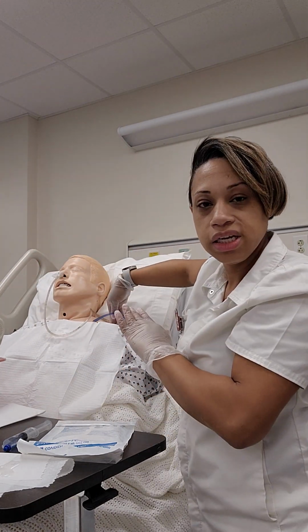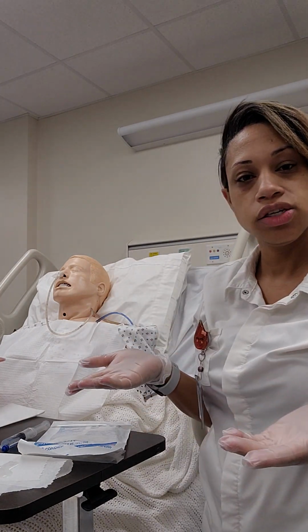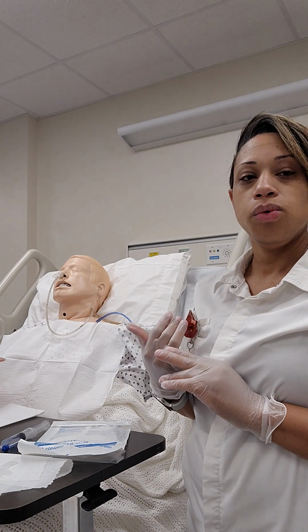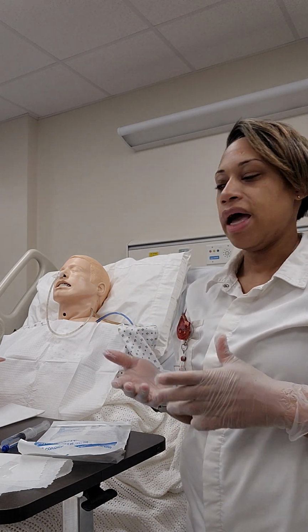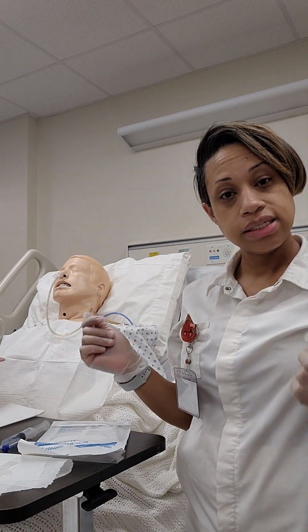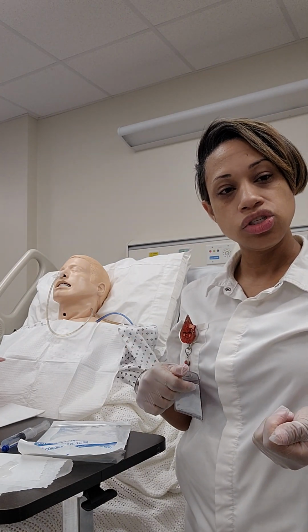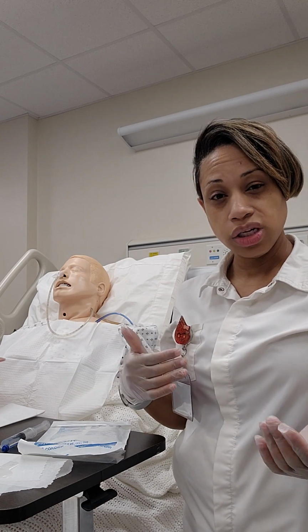So I'm going to temporarily tape that spot. And then I need to confirm placement. Ways to confirm placement will be I can withdraw gastric contents and check it against the pH, or I can get a chest x-ray depending on the doctor's orders.